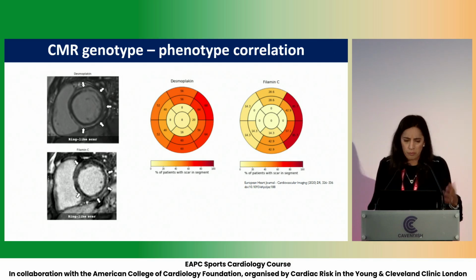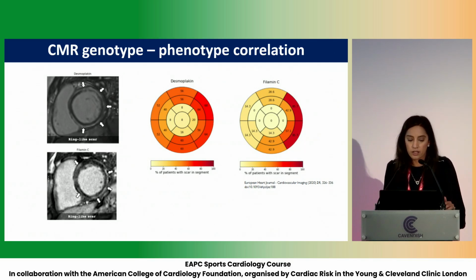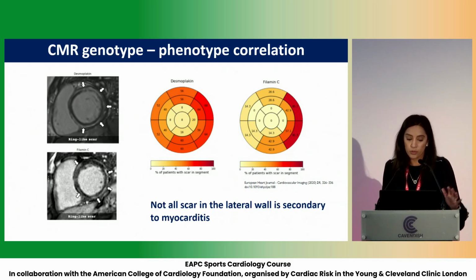So my take-home message here is that we need to be careful not to label certain cases as myocarditis, because not all lateral wall scar is due to this. And so you need to keep an open mind to the differential diagnosis, and this is where serial imaging does become important.